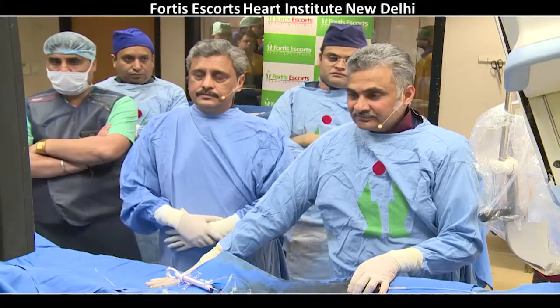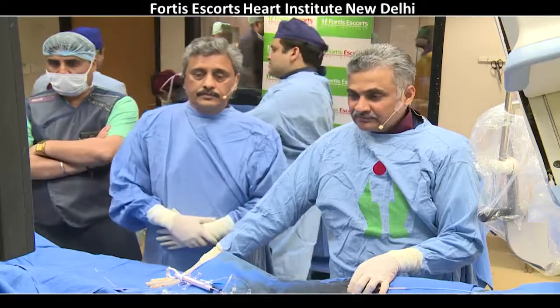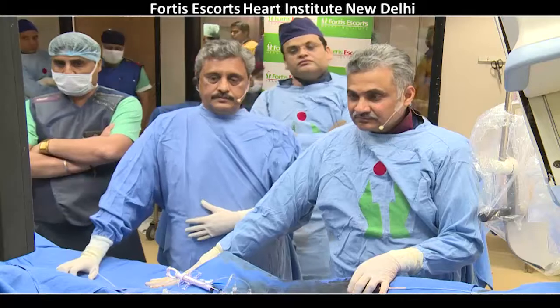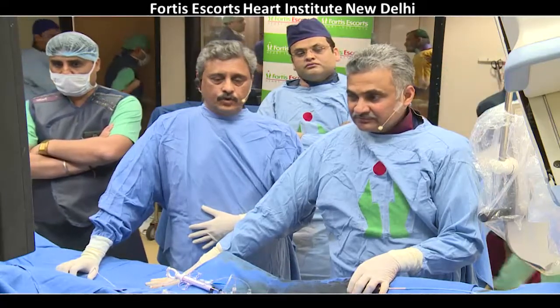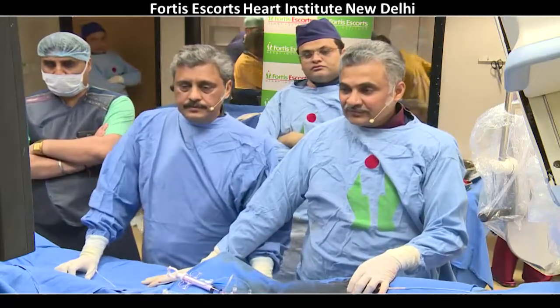Okay. If you just go back to the angiogram. Let's take it that it wasn't a surgical case. She was an obese, diabetic lady. So Atul's question, Dr. Mathur's question: it wasn't a surgical case, it was more of distal disease. How would you pre-dilate a fibrotic lesion?